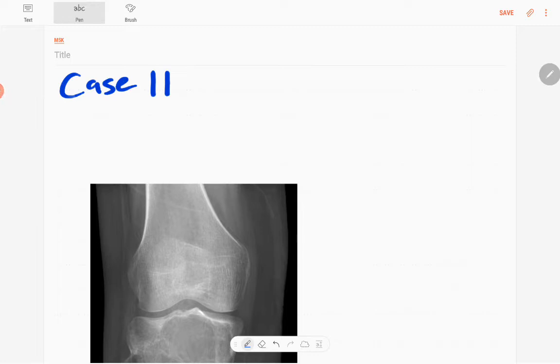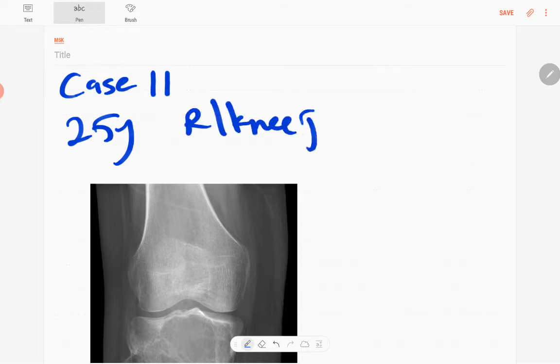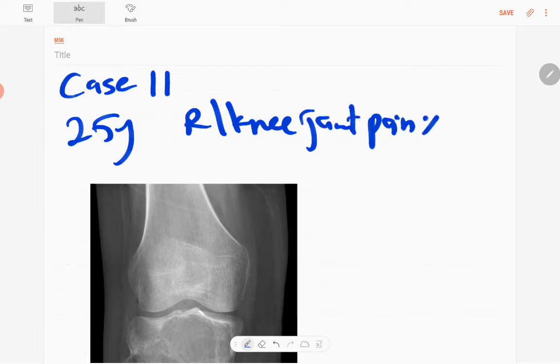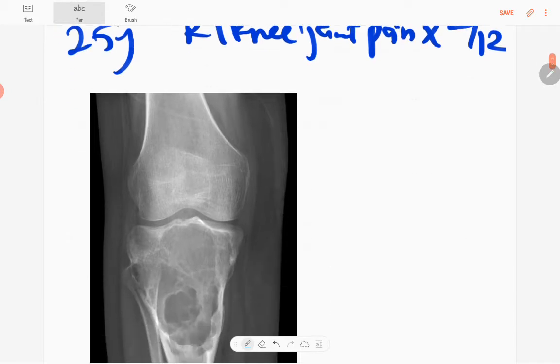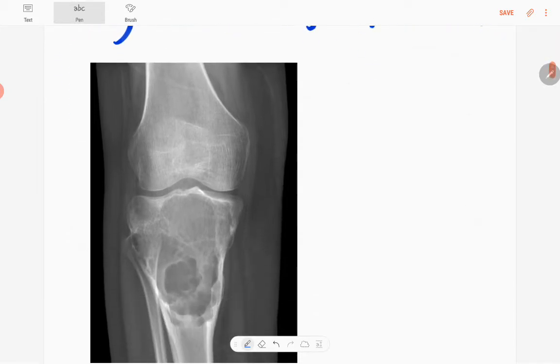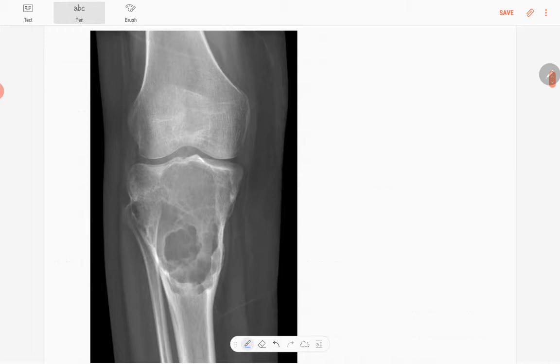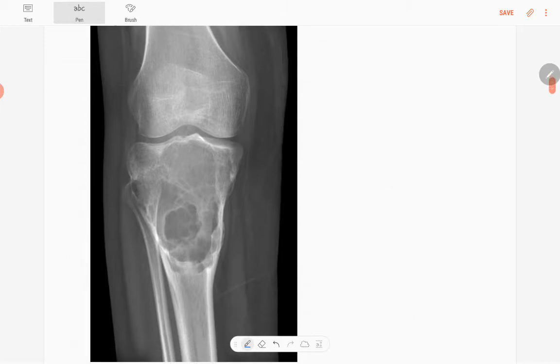Hi everyone, this is case number 11 of the MSK series. Today's case is a 25-year-old male patient who presented with right knee joint pain for two months duration. This is the anterior-posterior radiograph of the right knee joint.